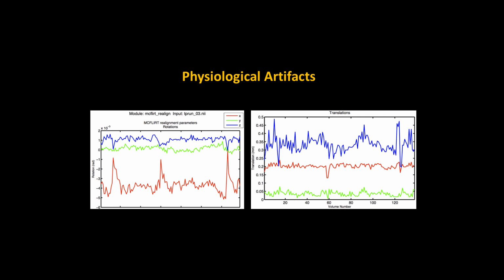So if you train the person appropriately, if you have them in the mock scanner, if they're comfortable, if you've taken into account what their attention span is like for that particular population, you don't make your scans too long, you can get around all of these really fancy pre-processing steps that we do after the fact to try to deal with it.